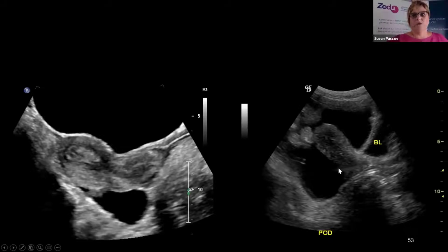There's lots and lots of fluid here, probably in someone more likely to have ascites, but the fluid then conforms around and it makes the bowel look like seaweed almost, or kelp, and you've got the fluid sort of fitting in amongst all those, forming sharp angles with things, fitting in amongst everything, filling up all the spaces.